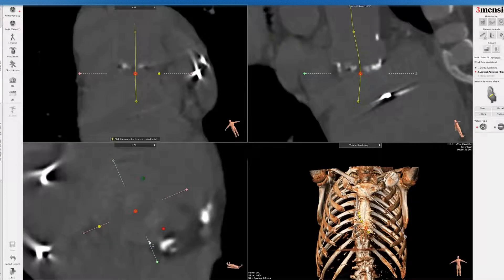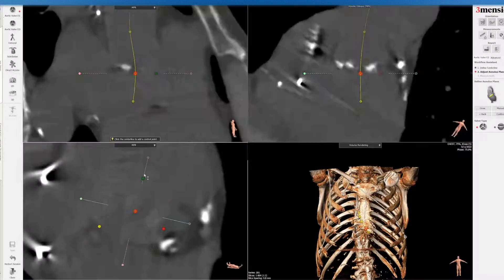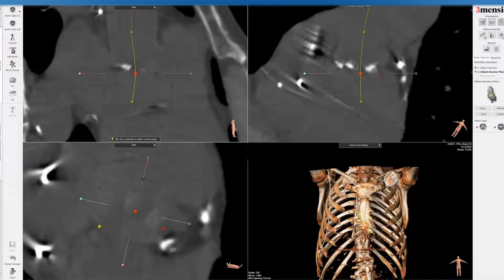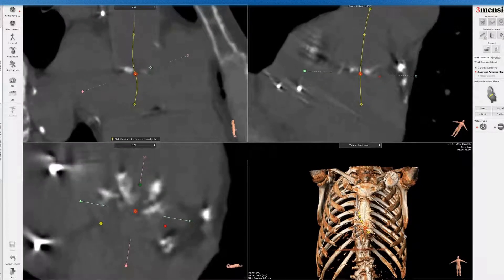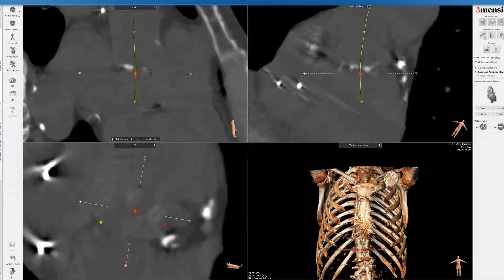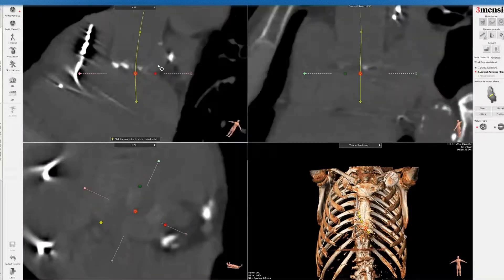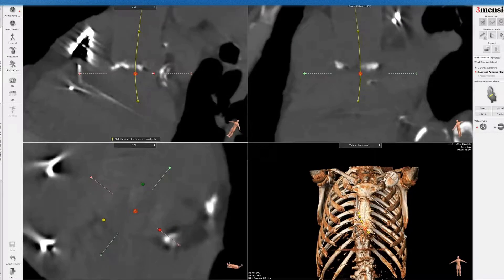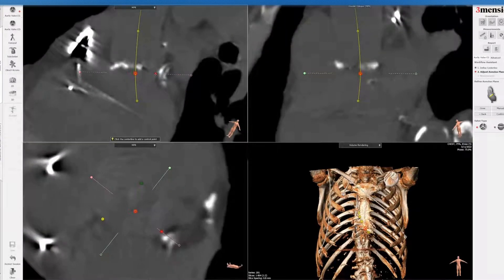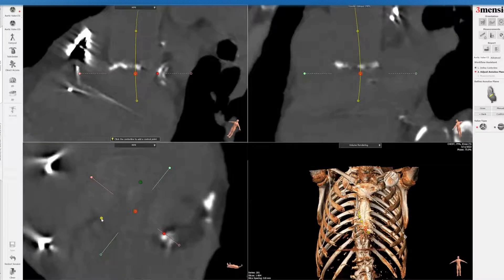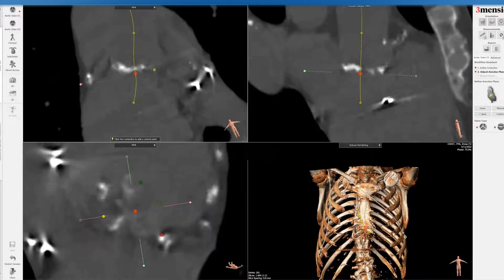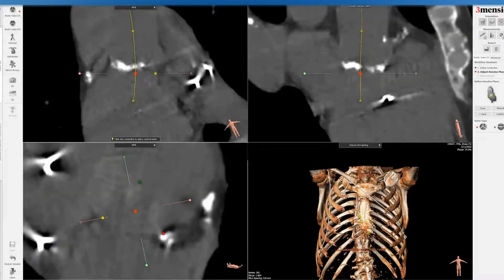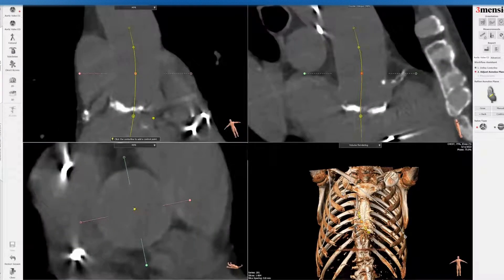I think there is maybe a hinge of the annulus here, so I'm going to leave it at that. Going to the next stop, which is the right side — you can see clearly I'm out of bounds, it's probably more like here. Now you can see the sinuses emerge. Going to the left sinus now — again I'm a little bit out of bounds, probably should be more like here. You can also change the gain to try to help, but it's definitely more challenging as you can see here.